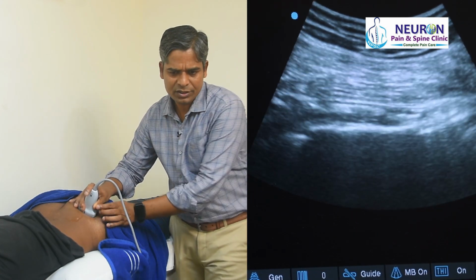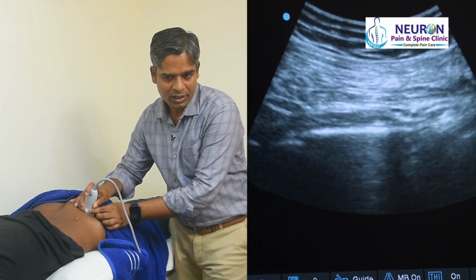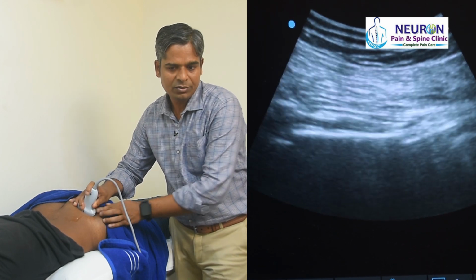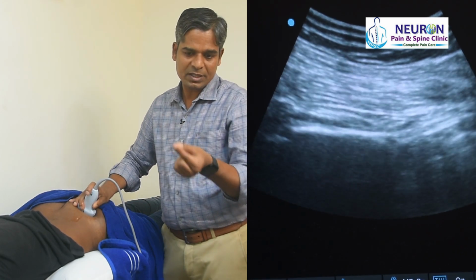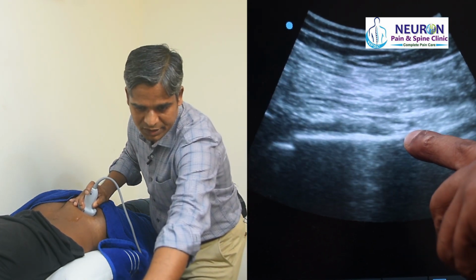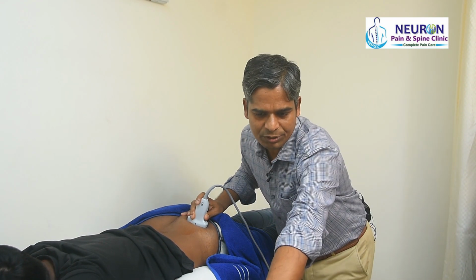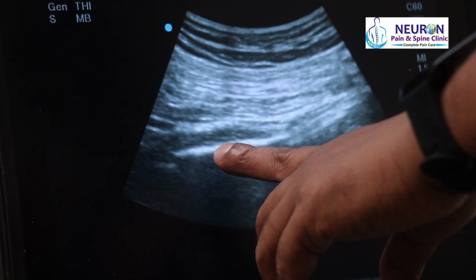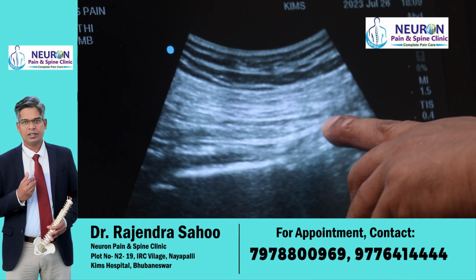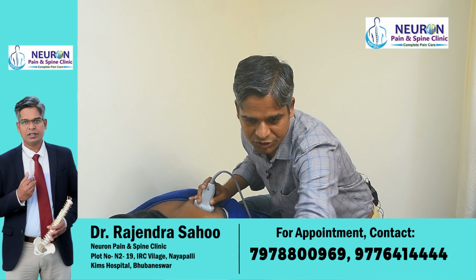Have a look at this. If I go down a little bit, scanning down, you don't see that continuity anymore. Going up, you see that continuity. If I go further up, you don't see it anymore. So for that specific location, there is the attachment of the sacrospinous ligament to the medial end of the ischial spine. At this level, you see the straightened ischial spine and the continuity of the line, that is the sacrospinous ligament. On the top, that white line is the sacrotuberous ligament. This is the gluteus maximus.